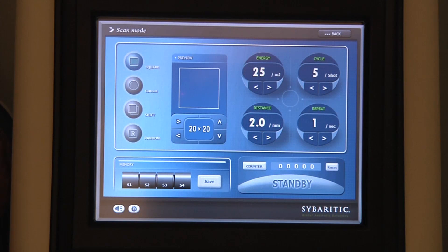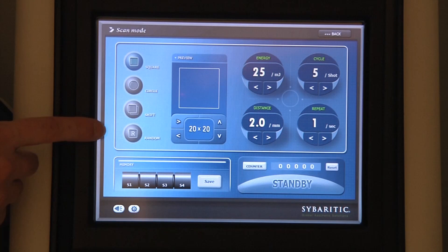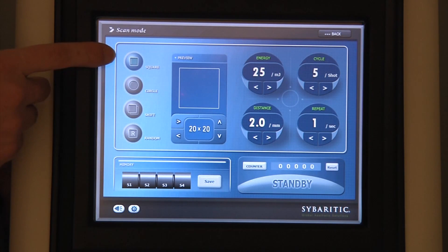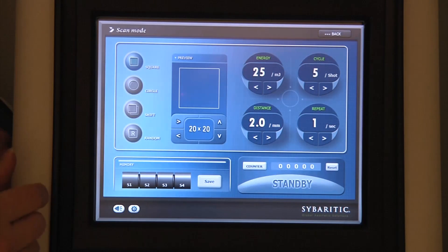In the scanning mode of operation, we have several parameters under our control. One is we can change the size and the shape of the scanning area. We're currently set to a square, which we can increase to a maximum of 20 millimeters by 20 millimeters.